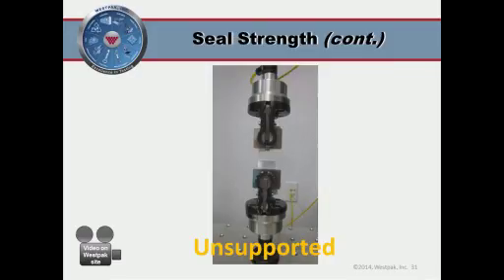And the answer is there are no standards that we're aware of. If it's intended that the device be dispensed from the pouch on the chevron seals, typically on the top, then those devices should be tested to that particular standard. And it's important to make sure that the seals are consistent, not necessarily minimum levels. We're not interested in that so much, but we are interested in consistent levels, and they should be sufficient to maintain integrity. But not so much that the one nurse, often called the dirty nurse, who takes the package and opens it onto the sterile field in an aseptic manner as best they can, tends to get pretty nervous and sometimes pretty darn upset with seals that are inconsistent.